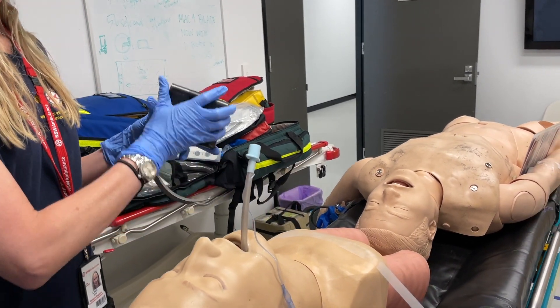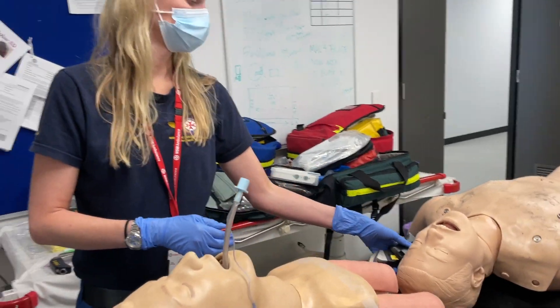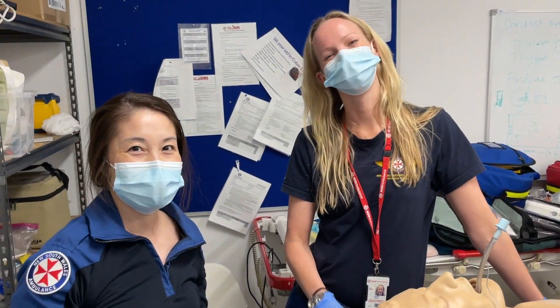That was Video Assisted Flexible Intubation, or VAFI, demonstrated by the Sydney HEMS team. Thank you, team.